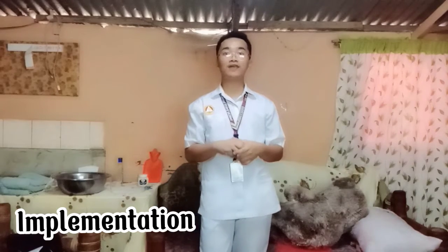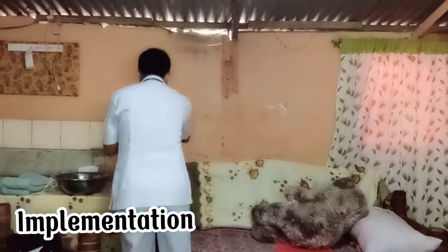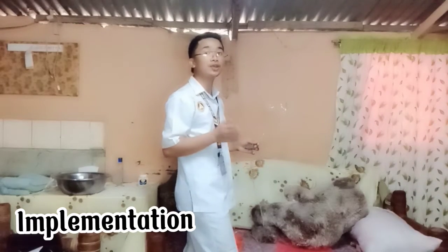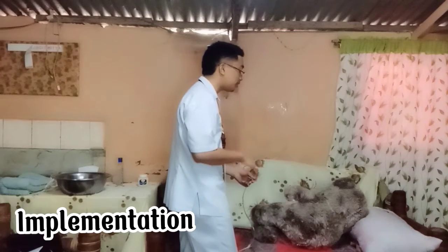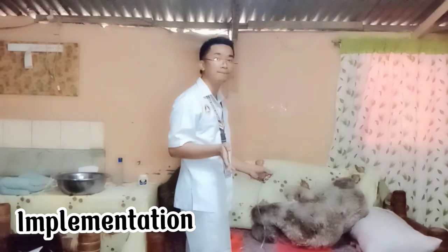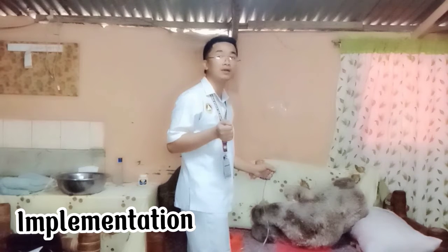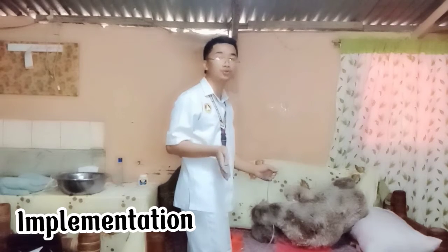Okay, so after that, we're going to insert the enema tube. For the client in a left lateral position, lift the upper buttocks. Insert the tube smoothly and slowly. Then, we need to insert it slowly in the rectum, directing toward the umbilicus. We need to insert only about 7 to 10 centimeters or 3 to 4 inches. If resistance is encountered at the internal sphincter, ask the client to take a deep breath, then run a small amount of solution through the tube.